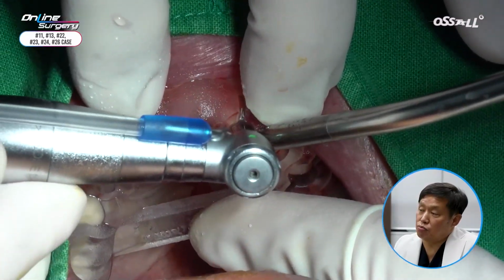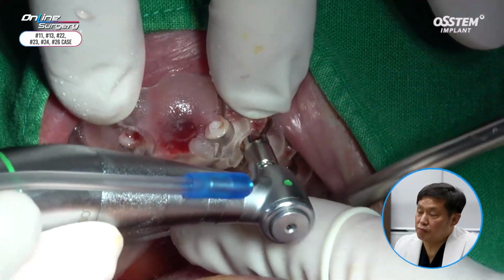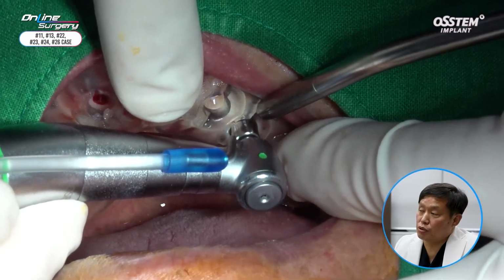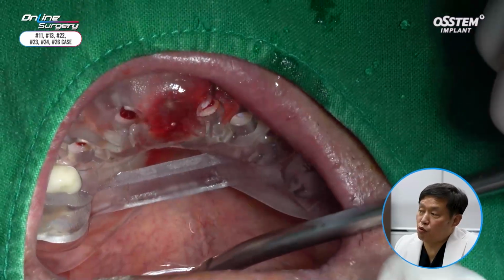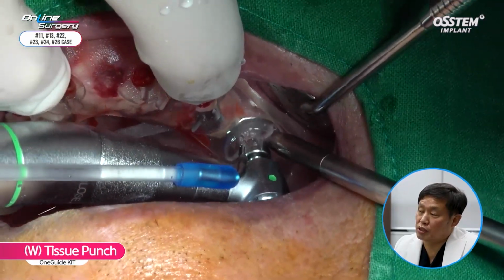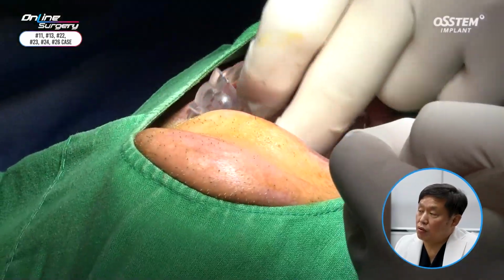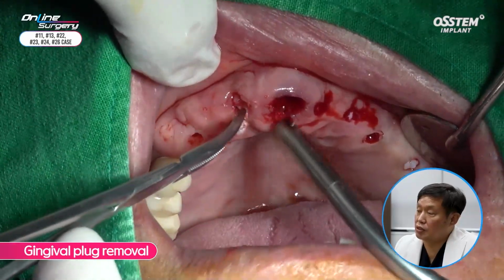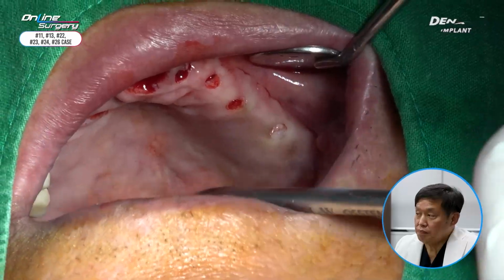Next is number 22, number 23, number 24. Overriding mucosa was removed using tissue punch. In number 26, this was wide hole, so wide tissue punch was used to remove overriding mucosa. Template was removed. I've checked whether there was any remaining overriding mucosa, and then surgery was proceeded.